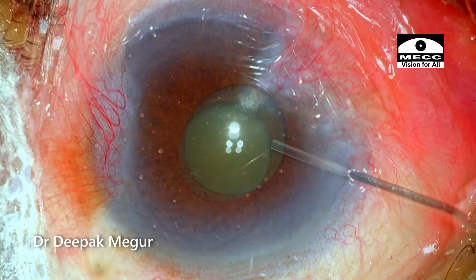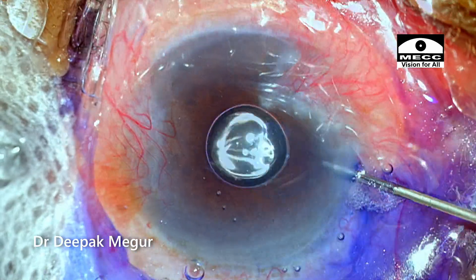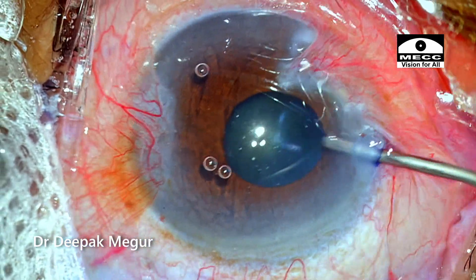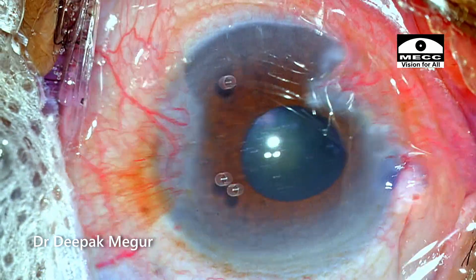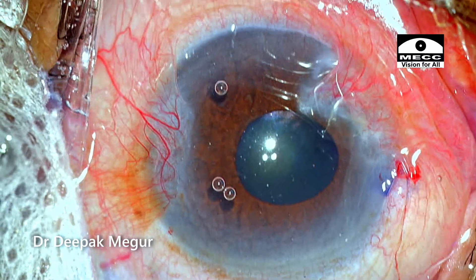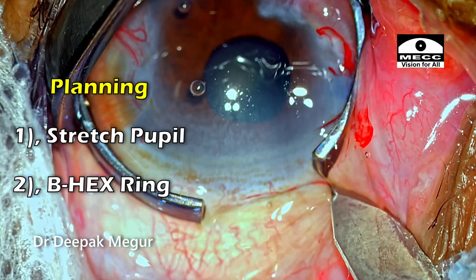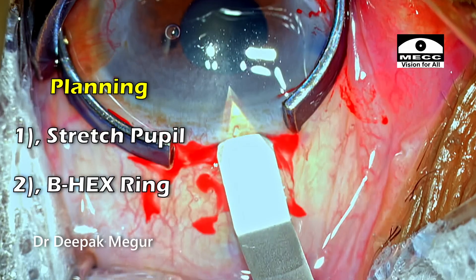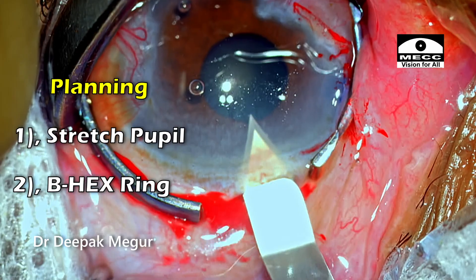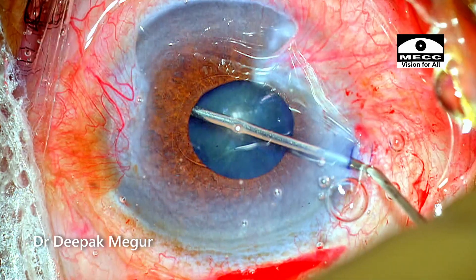The side ports are made and the anterior capsule is stained. As I'm putting the OVD into the eye, I expect the pupil to dilate a little bit, and then I'm going to take a call on whether to use a pupil expansion device or not. This is a rigid pupil as it doesn't dilate on injection of OVD. I need to do a stretching of the pupil to break some of the sphincter so that the pupil enlarges in size. After that, the iris is going to become very floppy, so I would want to use a device which holds the iris in place.